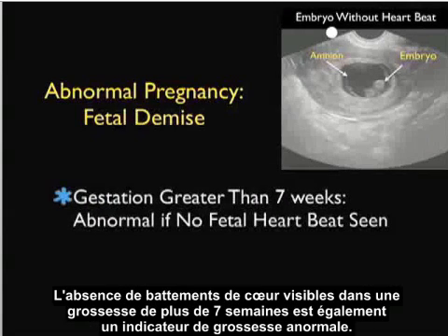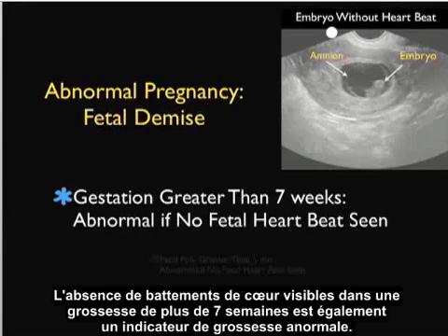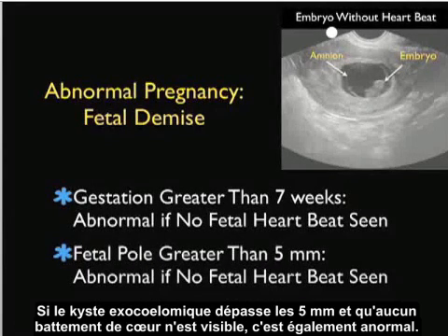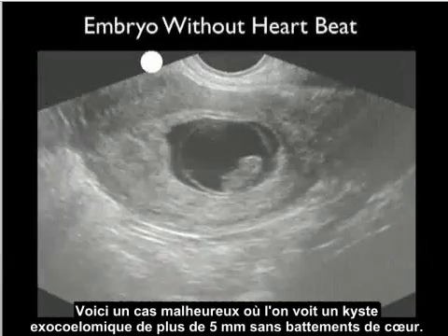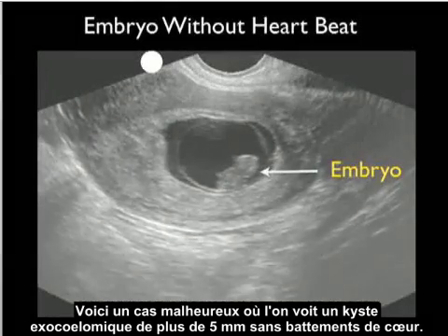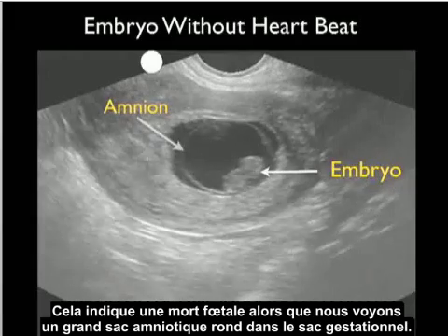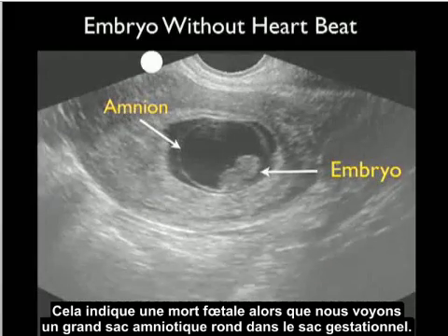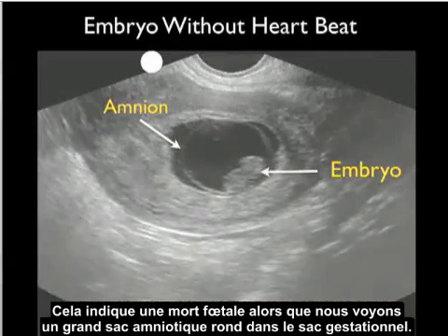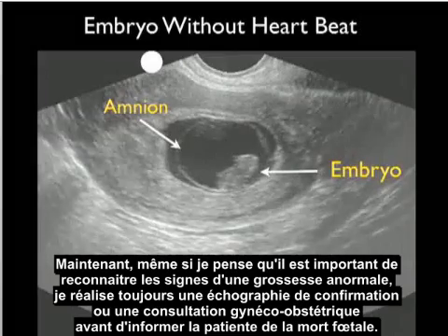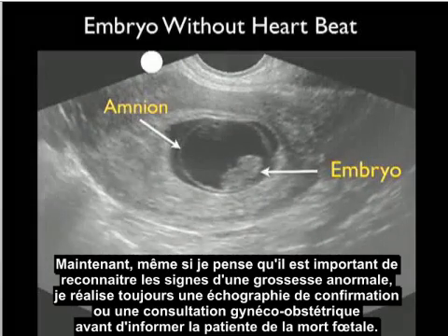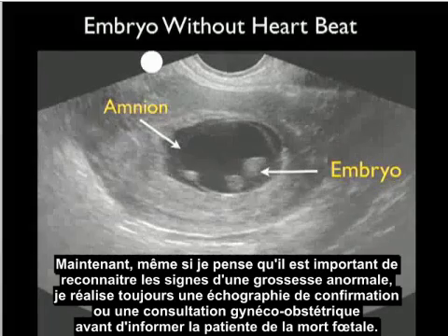Other indicators of an abnormal pregnancy with fetal demise: a gestation greater than 7 weeks is abnormal if no fetal heartbeat is seen, and if the fetal pole is greater than 5 millimeters in dimension, this is abnormal if no fetal heartbeat is seen. This was an unfortunate case in which we see a large fetal pole greater than 5 millimeters without a heartbeat, indicative of embryonic demise. We also see a large circular amnion within the gestational sac. I'll always get a confirmatory ultrasound and/or OBGYN consultation before giving the patient the news that there is a fetal demise.